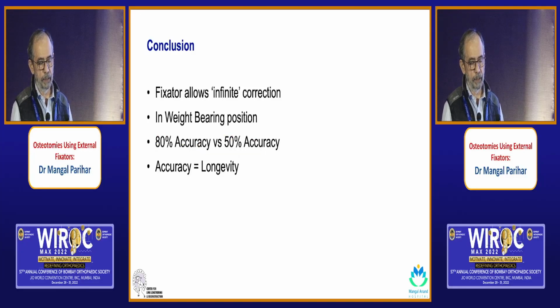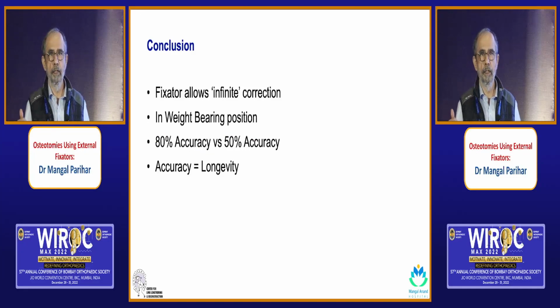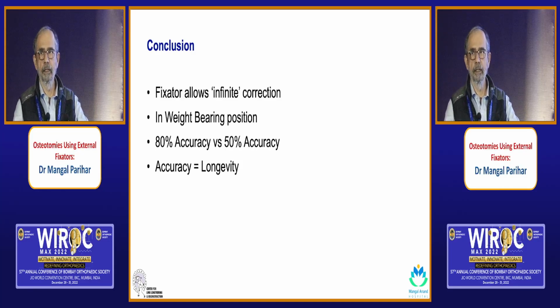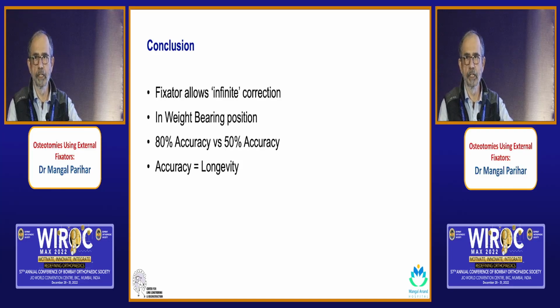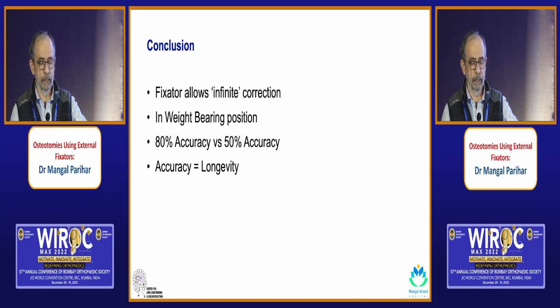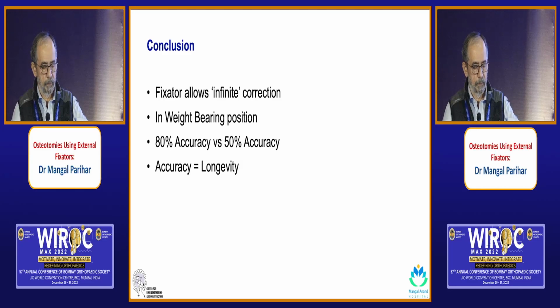So in conclusion, my reason for using the fixator is because for me the fixator allows for practically infinite adjustment after the surgery in a weight-bearing position, because I can do that full weight-bearing position at the end of that correction and see what exactly is happening. And for me, it's a question of 80% accuracy versus 50% accuracy. And till now, whatever we know is that the accuracy is equal to longevity of the result. Thank you.